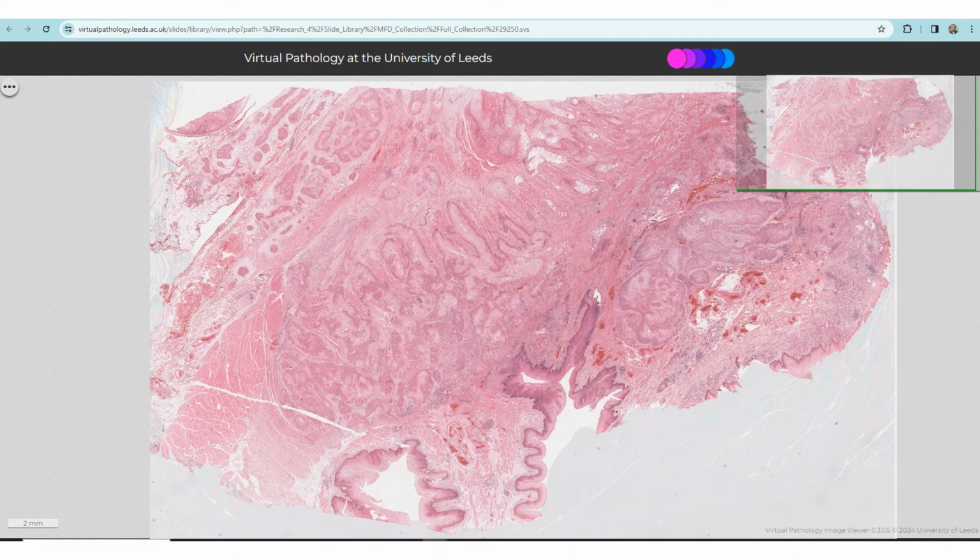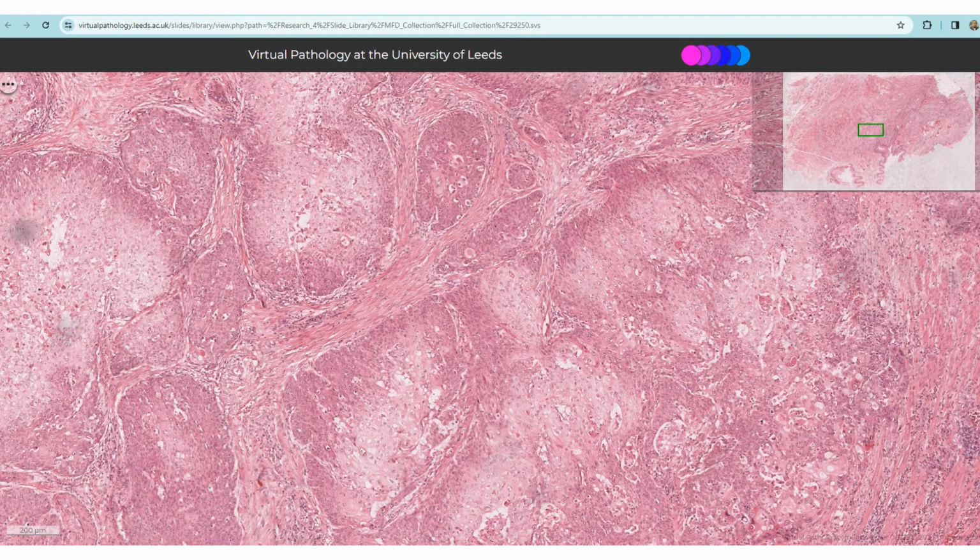Esophagus squamous cell carcinoma. When you open the slide, you can see there's benign squamous epithelium and there's invasive squamous cancer, malignant squamous cells, in nests. It has all 5 features of malignancy. In the center there's necrosis, and you can find a few small keratin pearls there and there.